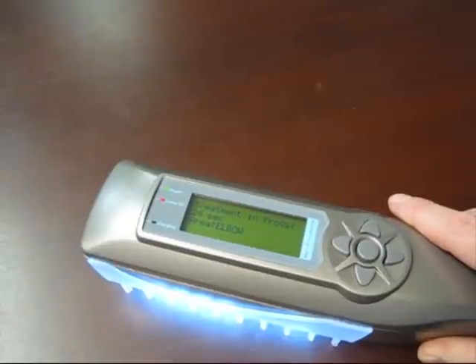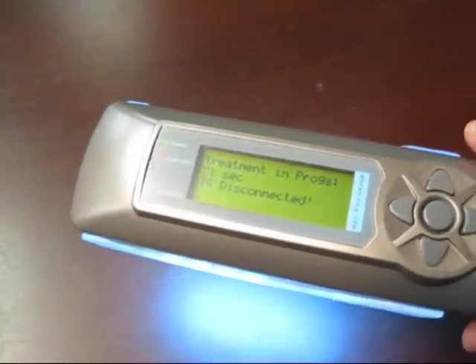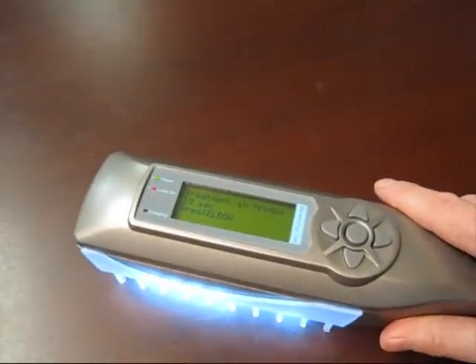Anytime the lamp moves too quickly or is held too far from the treatment area, it'll stop the treatment timer and indicate that it's not close enough to the treatment surface. Putting it back in place or moving it around slightly should start the timer and reconnect the infrared detection.